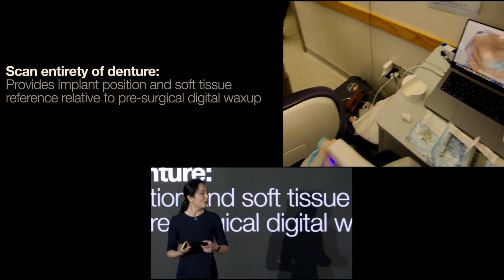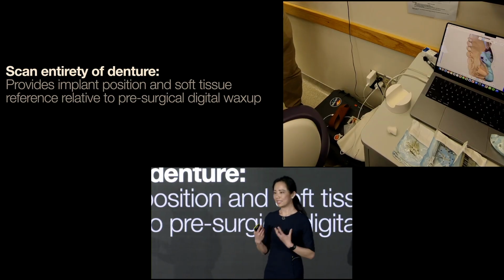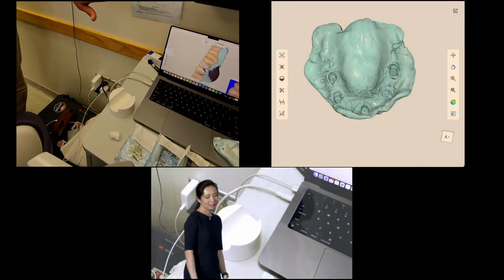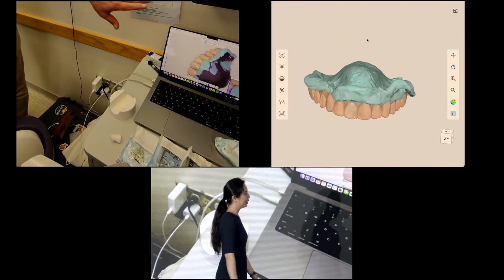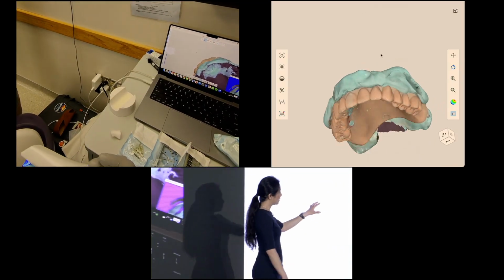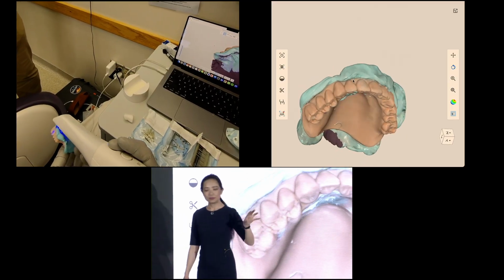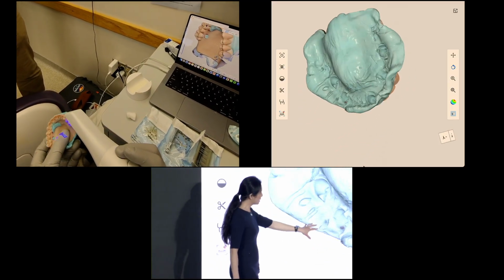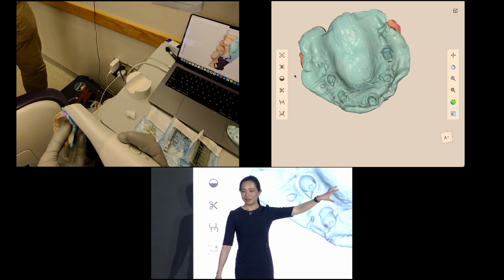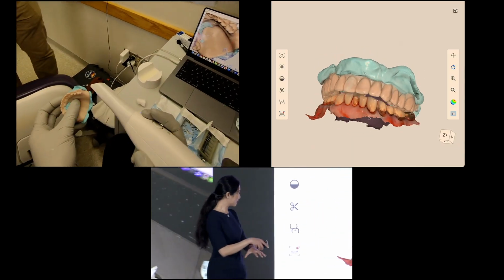So at this point, I'm not relying on biologic markers, but straight up relying on my digital data being accurate. And from there, you can see the scan and where the white caps are. The important factor is not getting a perfect impression of all of the white caps. The most important factor here is reestablishing the positioning of at least 2 to 3 of these white caps back into where the teeth setup is on exocad.